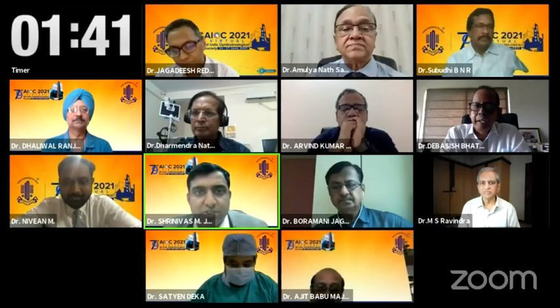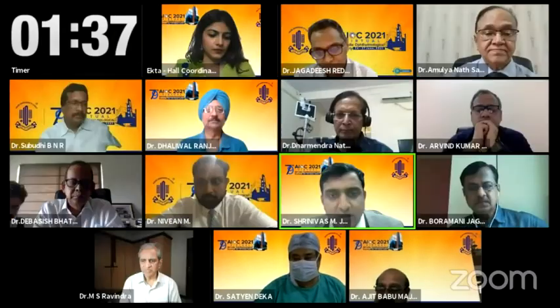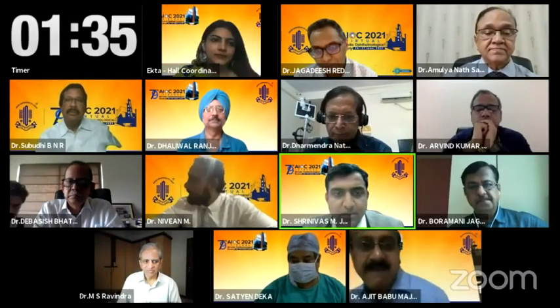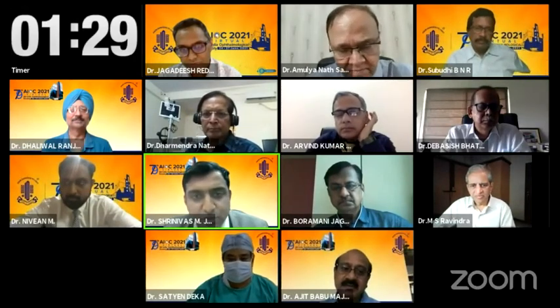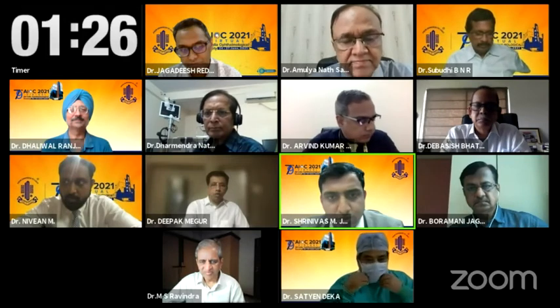Thank you so much, Dr. Jagdish. Thank you, Debasish sir, for summarizing so well. Thank you, Ranjit sir. One quick question to Dr. M.S. Ravindra sir. Sir, what is the grade of the cataract you would look into when you're using the cystitome while breaking it in the AC? And is there any choice of viscoelastic you would like to use?